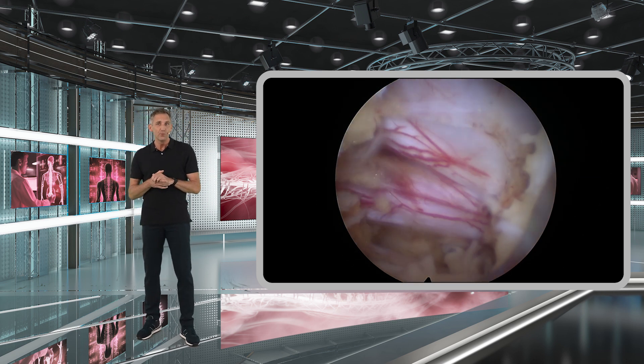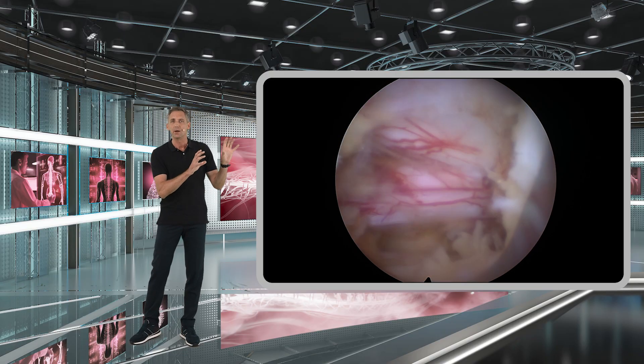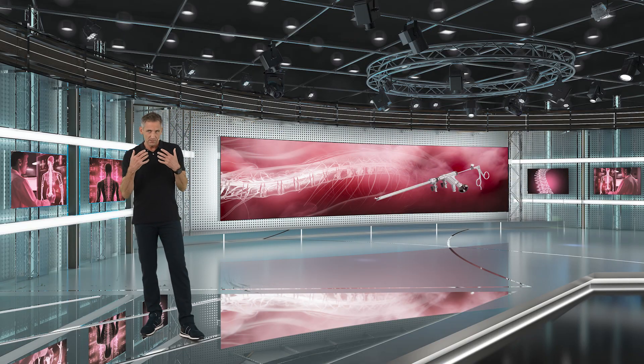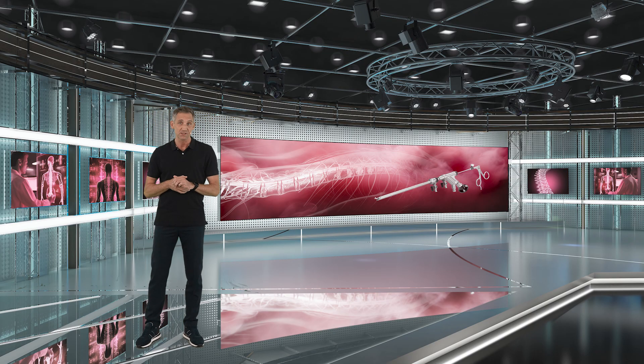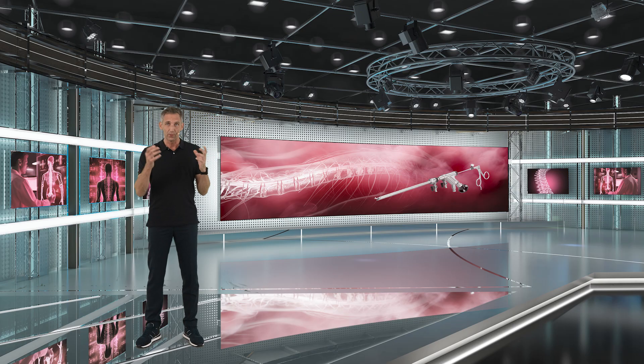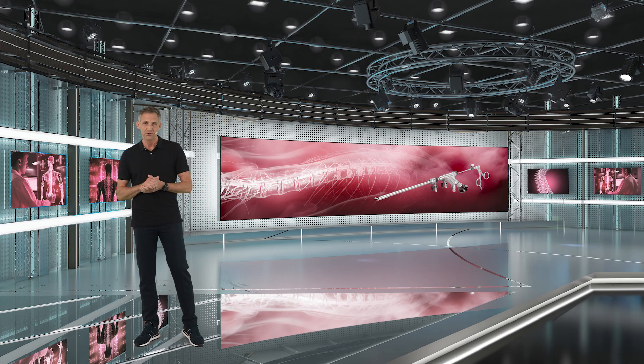It's not necessary to remove these fat tissues from a decompression point of view — the decompression is already done — but it will simply improve your vision very much, which is important for your anatomic orientation and for performing your surgery safely.